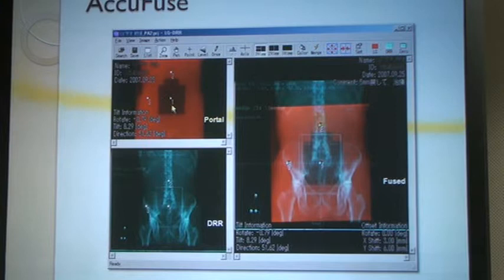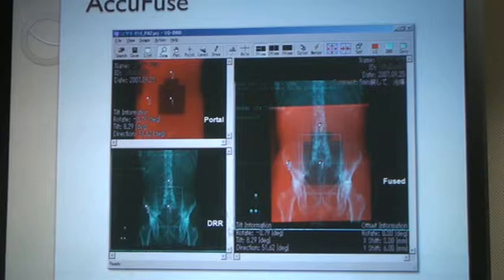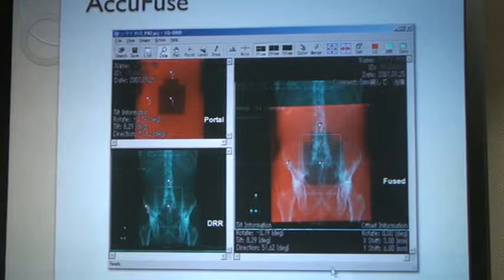With this software, you place control points at the isocenter and then 10 centimeters orthogonal, and do that on the DRR image and the portal image. Then it will fuse these two images so that you can use bony features to estimate the patient's setup error. The Y shift and X shift here tell you the required correction.